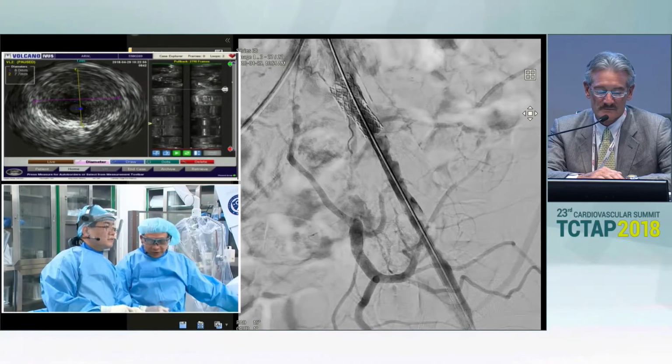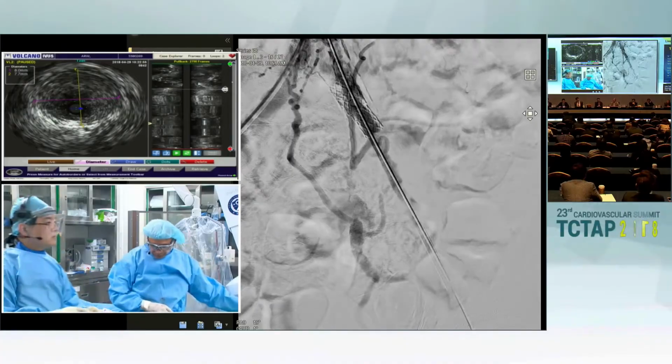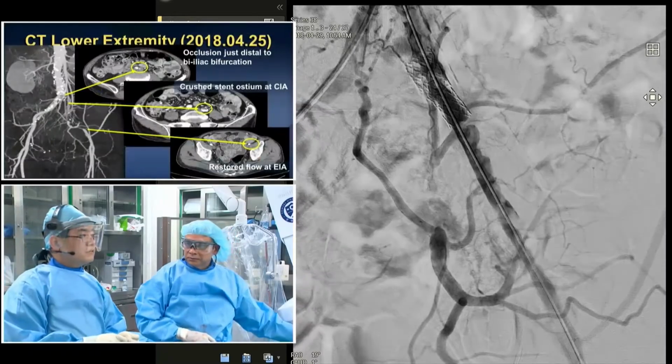Yeah. Okay. So what, 8? No, that's a covered stent.